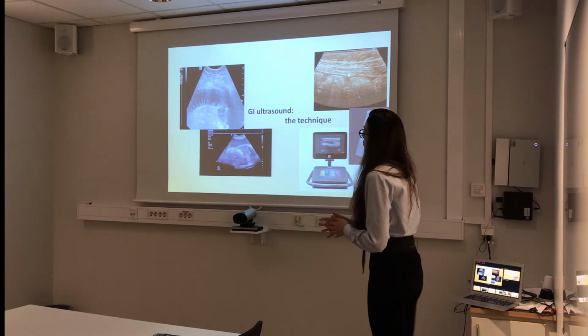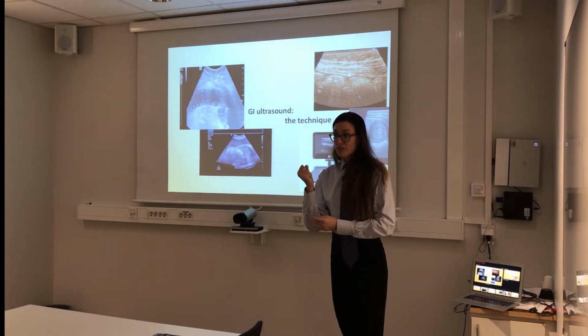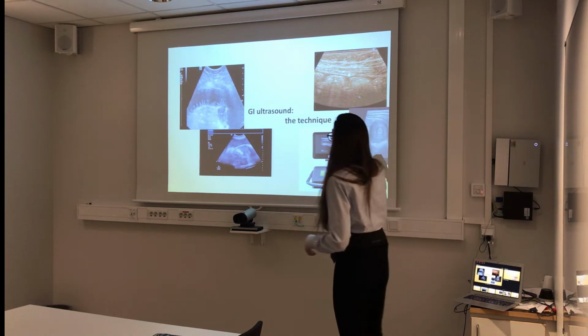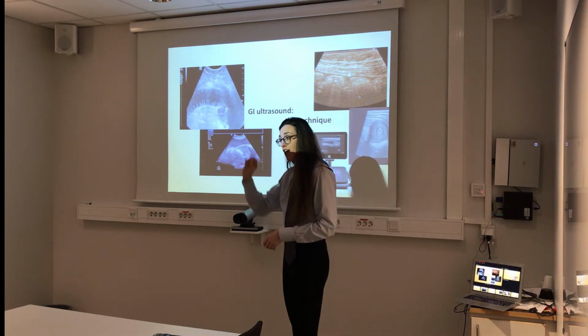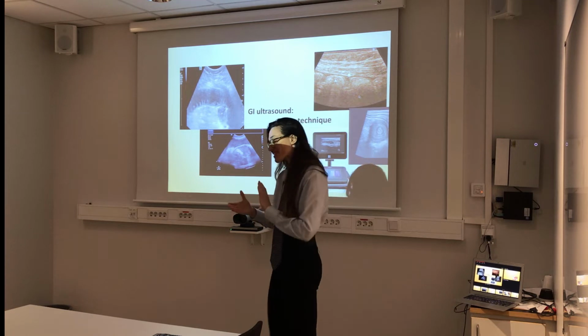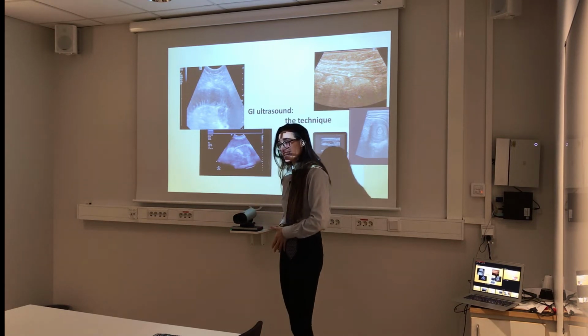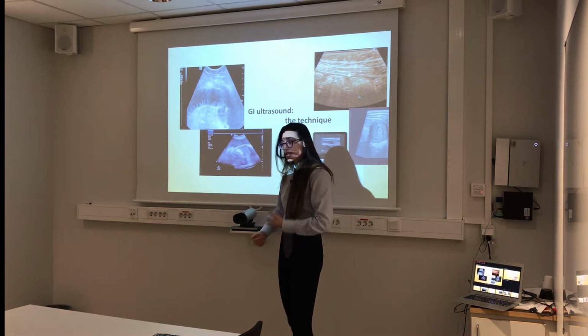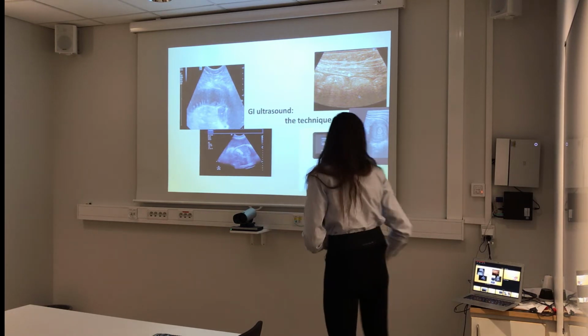So, GI and ultrasound, let's talk about the technique very briefly, and then we will talk about SBO. Because this introduction is just to point out the fact, again, colon is here, small bowel could be visualized. So if you see the small bowel is not pathological, many times people look at the appendicitis, and because the small bowel is rounded, they confuse appendix with the small bowel. So that's why you need to learn the characteristic, and then it's not pathological.